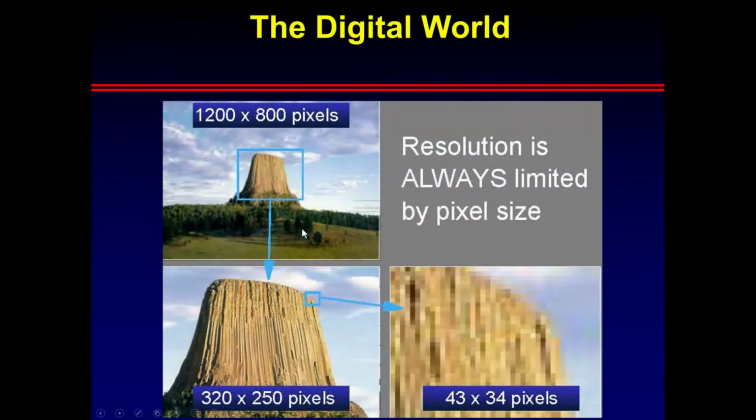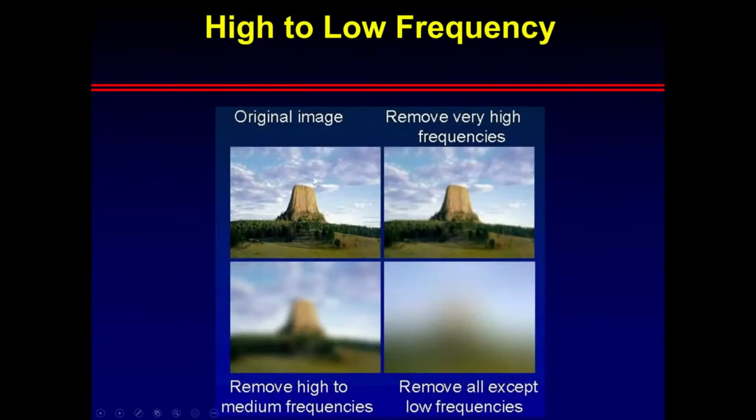That's why we have cut points in terms of where we cut out high frequencies and where we keep some and take out others, okay? And that's to help improve our overall spatial resolution.